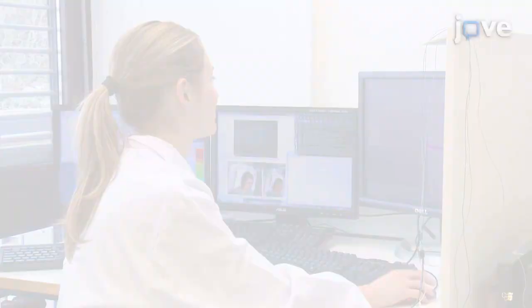The execution of the protocol requires many complex manual actions such as electrode application, which are faster and easier to learn through visual demonstration. Demonstrating the procedure will be Sandra Gebhardt, a student from my laboratory who is trained as an experimenter for this study.